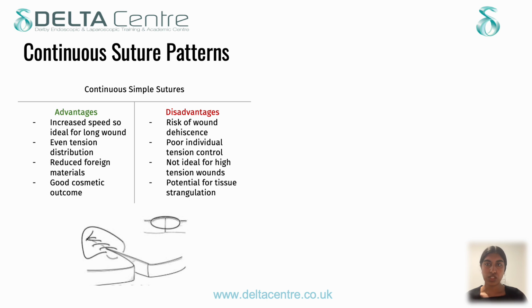There's even tension distribution along the entire wound, which helps in even healing and allows for good cosmetic outcomes. There is a reduced foreign material, as there's only one knot at the start and one knot at the end, which reduces the risk of infection, and there is good cosmetic outcome.